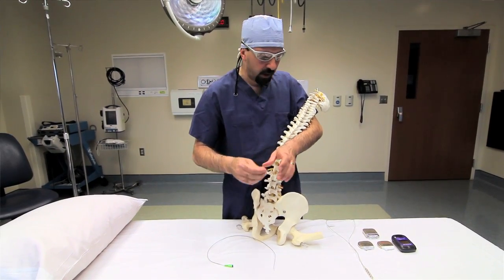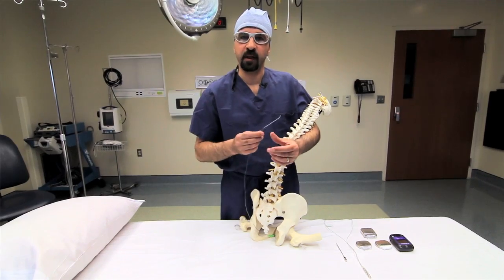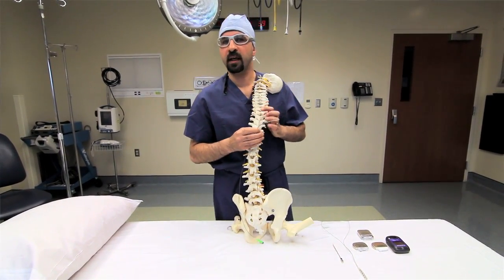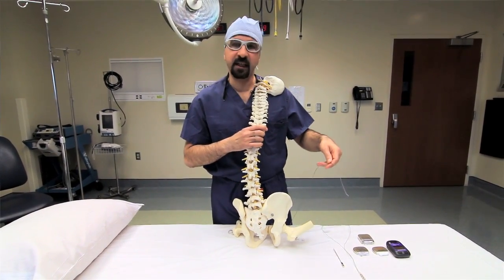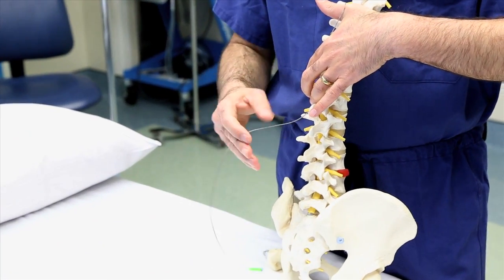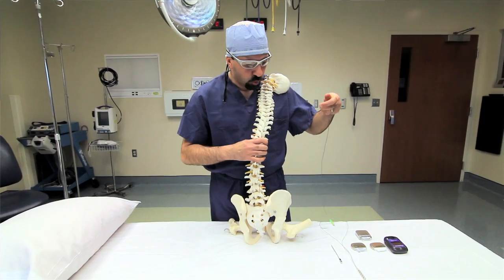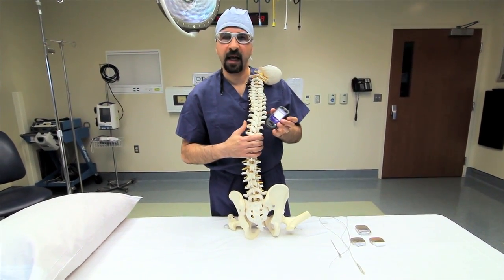Then during the trial, while the patient is on the table, we test the patient for the stimulation, and once they say it's covering all the area, we take the needle out, leave half of the lead inside and the other half outside, connected to a controller that the patient uses in their hand.